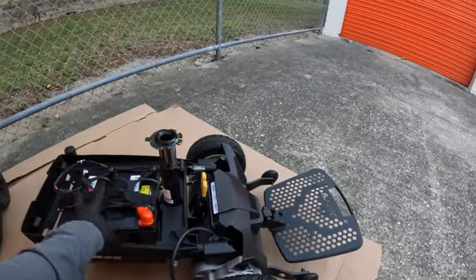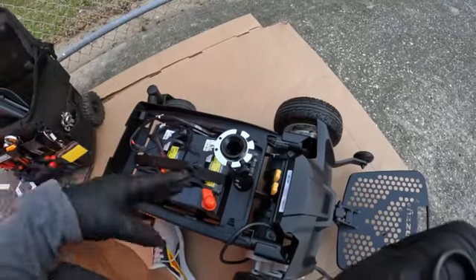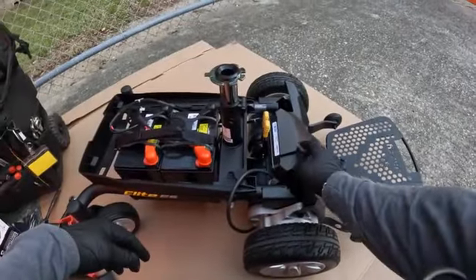These are your two batteries, U1 batteries. These actually have a quick connect, which is pretty cool. Little connectors right here, they just pop out. It's a 2-pin connection, or I don't know what they're really called, but anyways, they just quick connect. You disconnect those and you could take the batteries off and make the unit a little bit easier to carry.